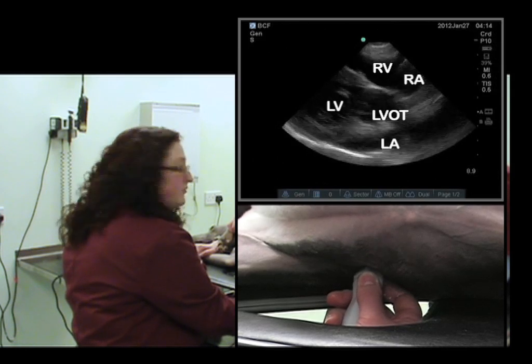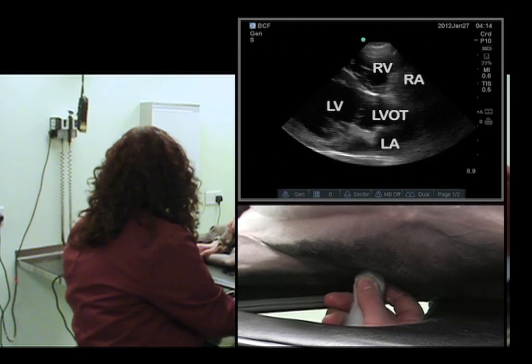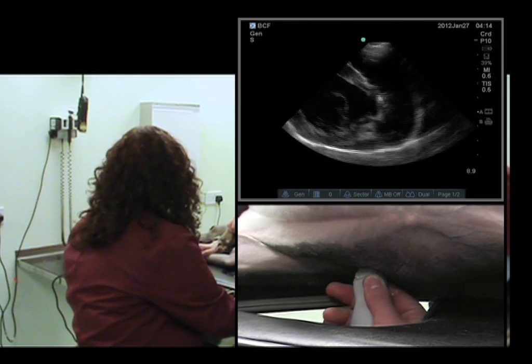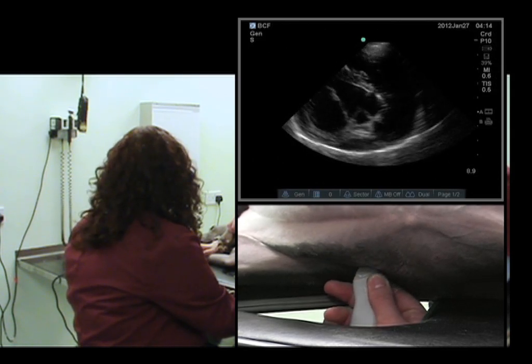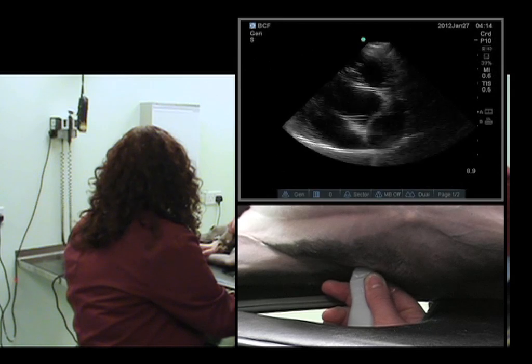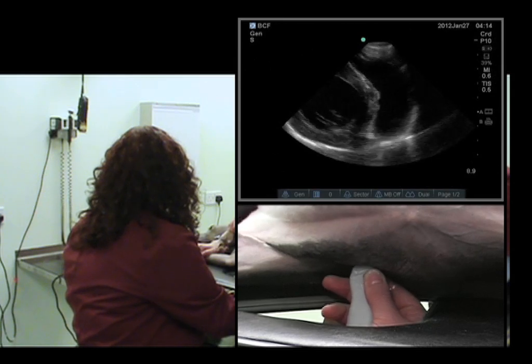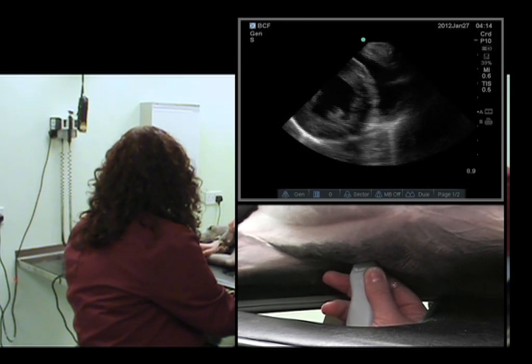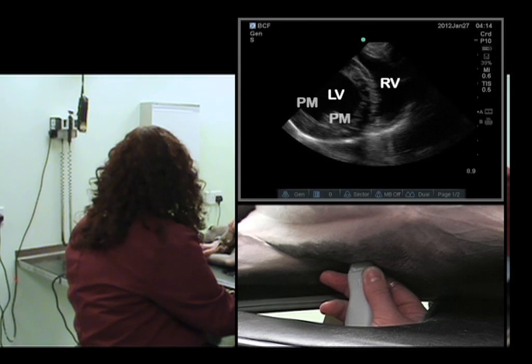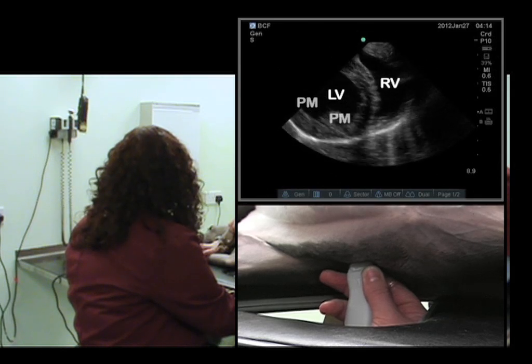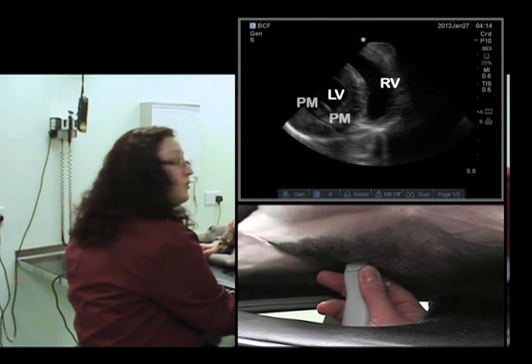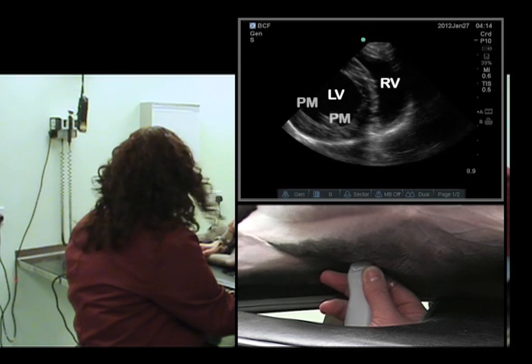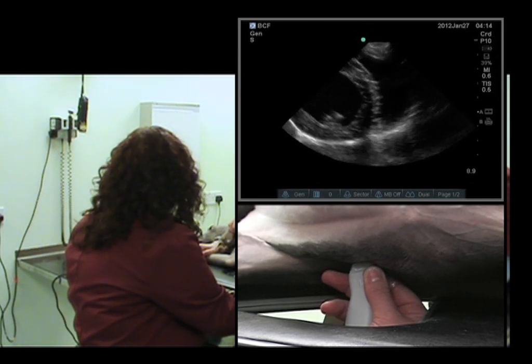We have our five-chamber view, and then we have our mushroom view. The papillary muscles are just popping in there.